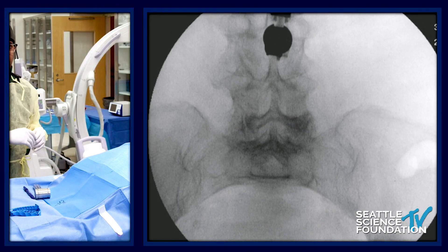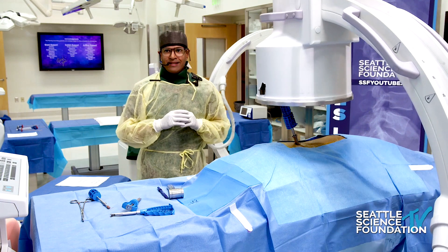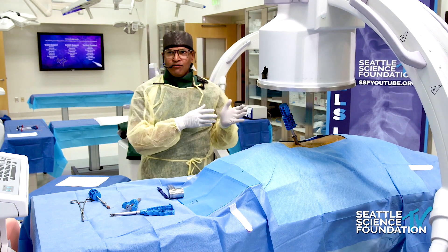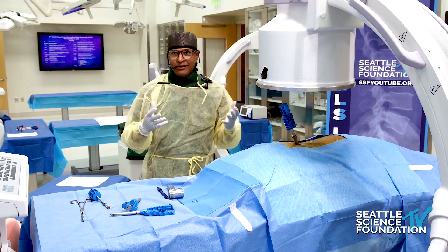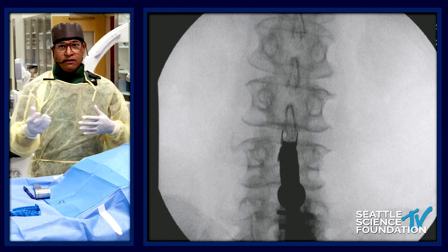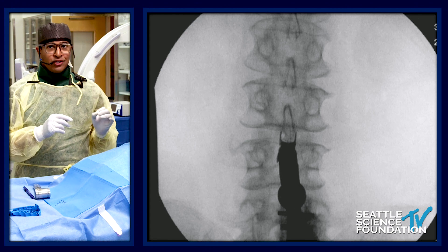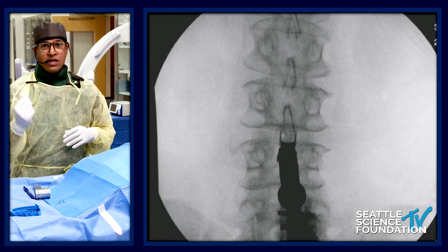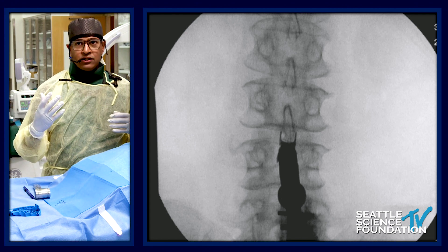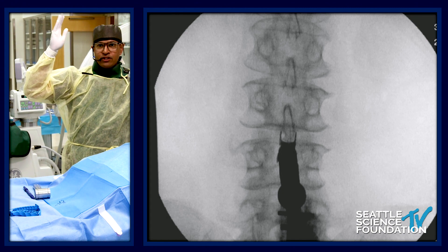Once you get to about 90 degrees of opening, check AP. I'm doing the sagittal arc — force forward towards the head, force towards the foot, back to the middle, then deploy. It was much easier, which tells us we're in soft tissue. On AP you can see the cam lobes — there's a field goal. That looks great. We'll check the bottom as well. Don't just sit on your laurels — the bottom may be in a completely different location.